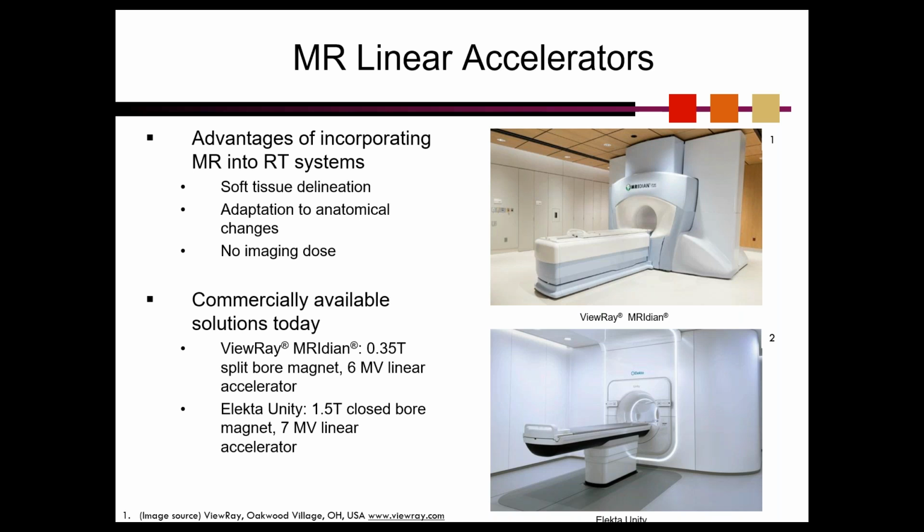As of today, there are two commercially available MR-linac solutions, namely the ViewRay Meridian Linear Accelerator, which includes a 0.35 Tesla split-bore magnet and a 6 MV linear accelerator, as well as the Elekta Unity, which includes a 1.5 Tesla closed-bore magnet and a 7 MV linear accelerator.